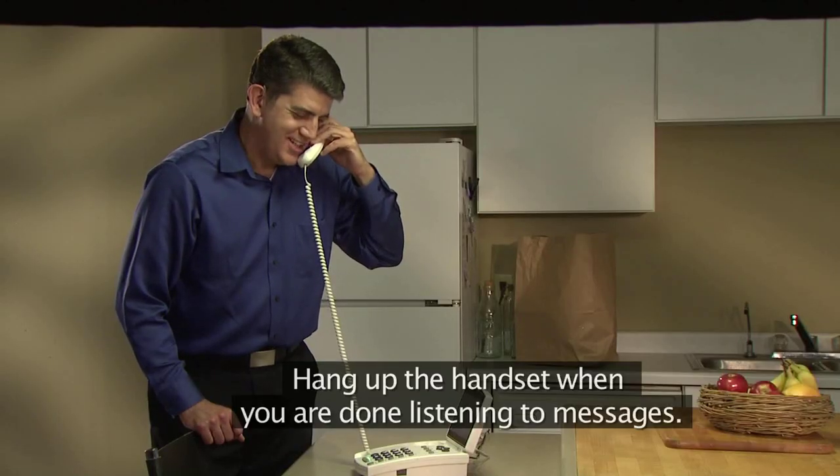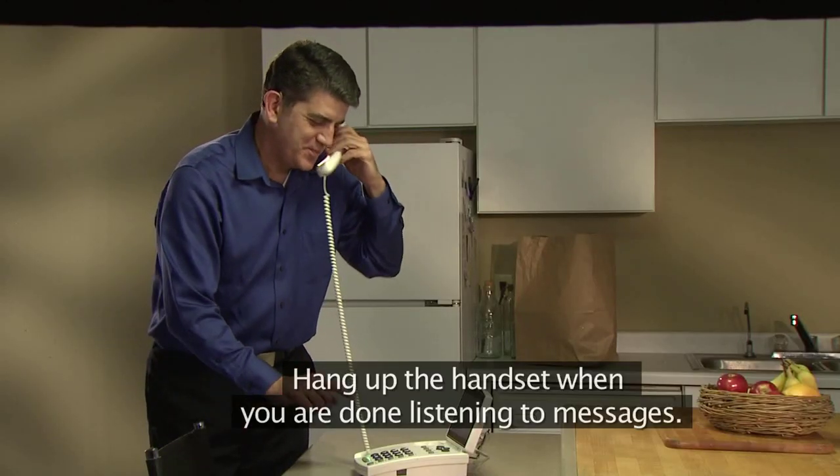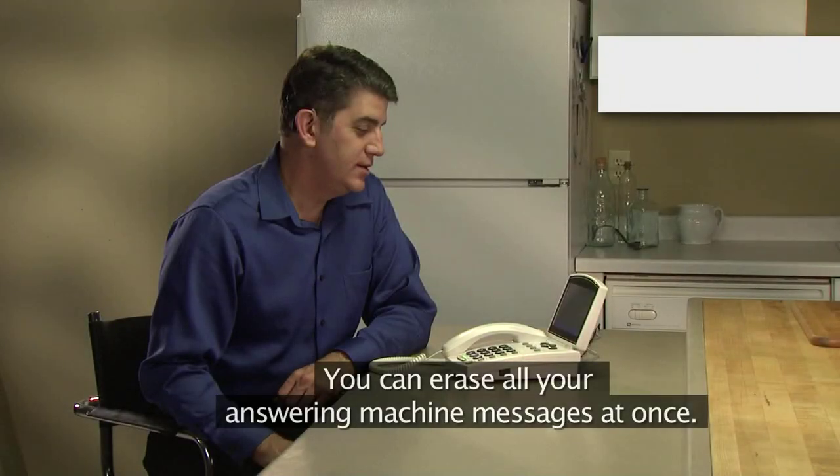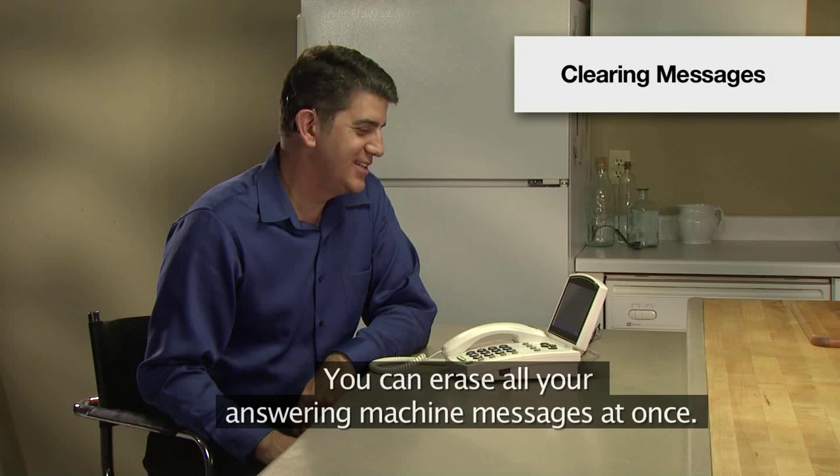Hang up the handset when you are done listening to messages. You can also erase all your answering machine messages at once.